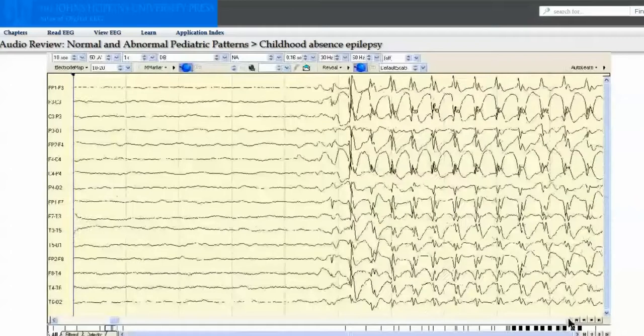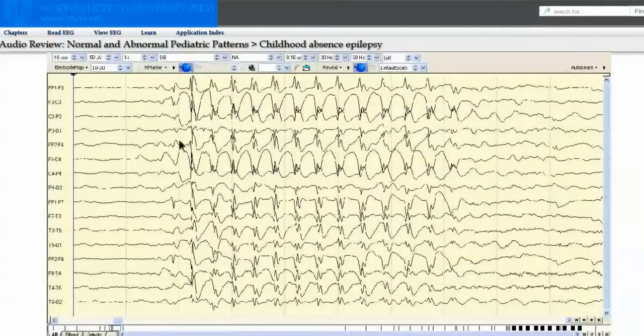as we advance the page, that this burst comes out of equal voltage background, largely with some sleep-like activity with spindles, and appears with a phase reversal over F3 and often, in many cases, on the opposite side at F4. Shortly thereafter, though, there is the appearance of spike and then slow wave discharge. In this case, the discharge frequency is at 2.5 per second, or almost 3.